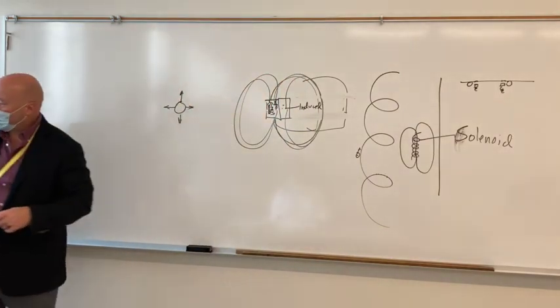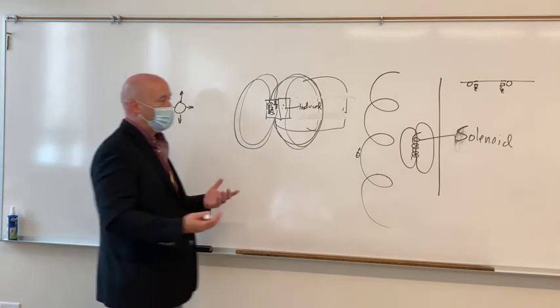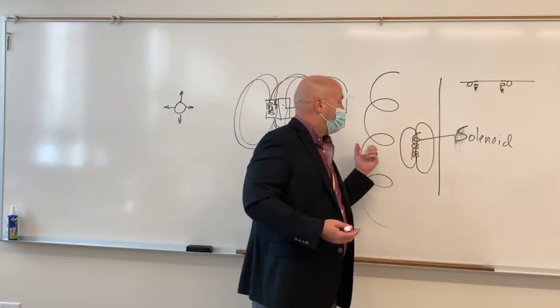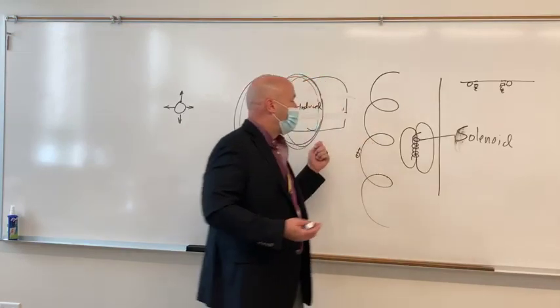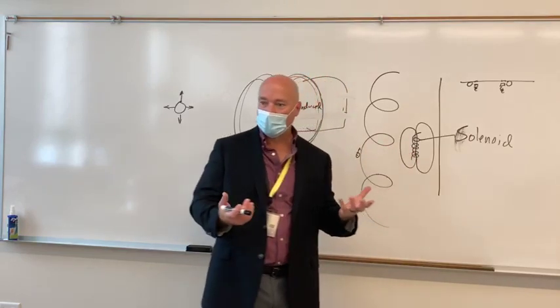And that is, going back to Faraday's laws, the magnitude depends on the induced current, but it really applies also to the amount of magnetism that we're going to create. The more current that we push through a wire, the more magnetism we're going to create.